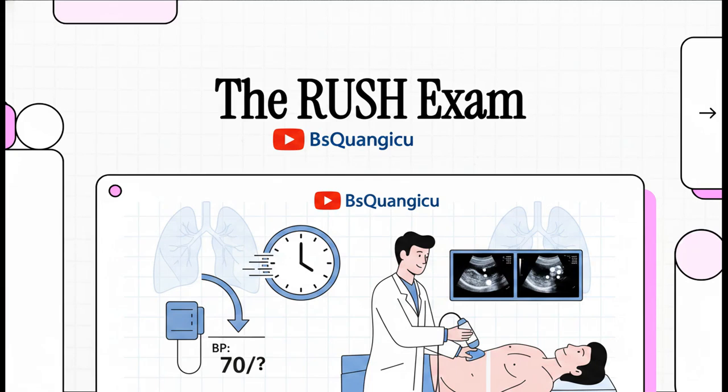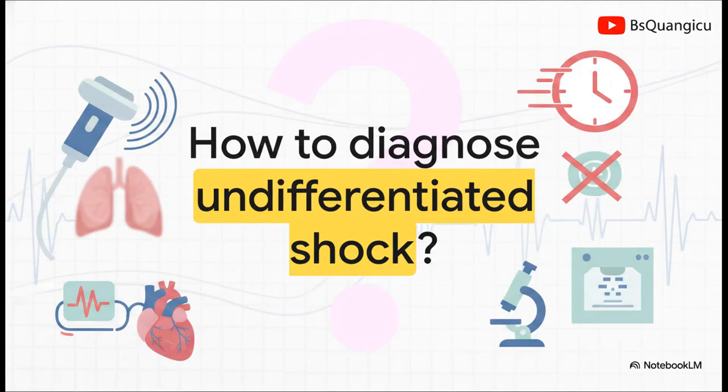All right, picture this. You're at the bedside, the patient is hypotensive, crashing fast, and the clock is absolutely ticking. It's that high-stakes, sweat-inducing scenario we all dread, but absolutely have to be ready for. You need answers, and you need them literally right now. So here's the million-dollar question. How do you quickly diagnose undifferentiated shock?